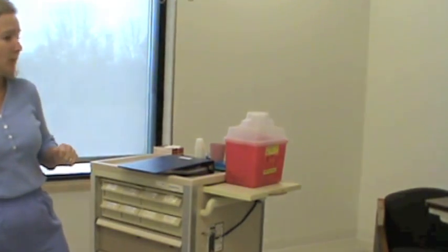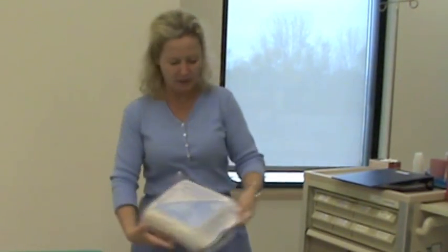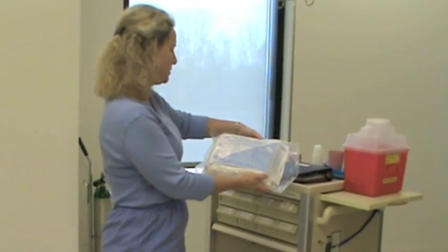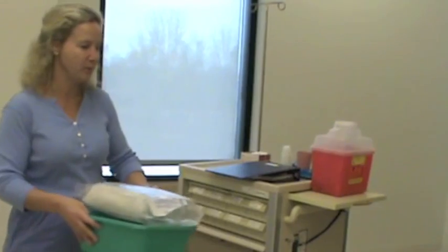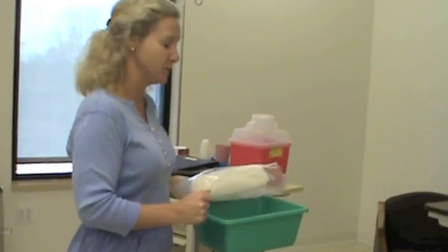I'm going to gather my equipment. I'm going to wash my hands and make sure that I have a basin, a towel, and wash cloths because I want to clean her perineum and visualize the urethra before I'm sterile. Then I'm going to get my Foley catheterization tray, which is sterile. It has the complete contents of what I need to insert the Foley. It's 16 French with a 5 milliliter balloon and it's not expired.